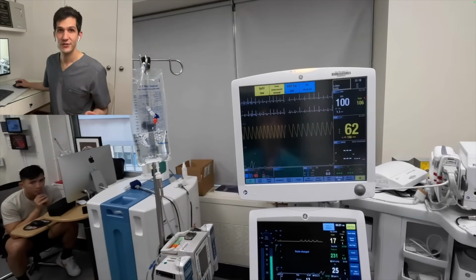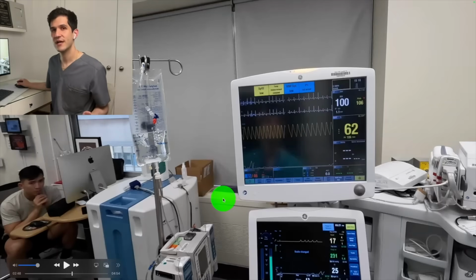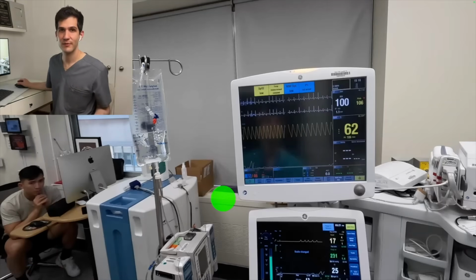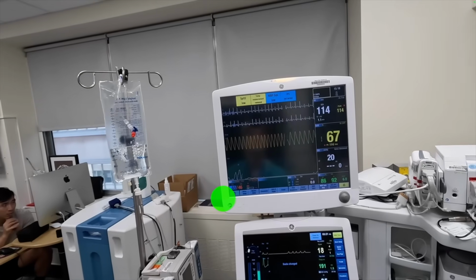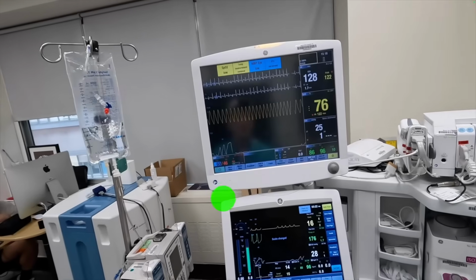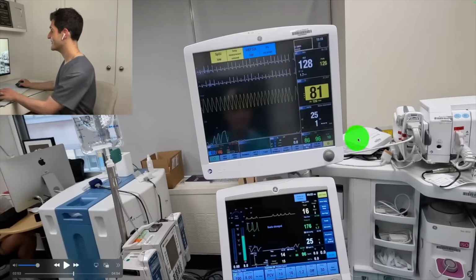You can see that the blood pressure cuff had just cycled and the patient's blood pressure dropped significantly, which is not surprising because anesthetic agents tend to drop blood pressure, but also the heart rate had slowed down considerably. And for pediatric patients, their blood pressure depends in large part on their heart rate, much more so than adults. So I'm not surprised to see that the patient has become extremely hypotensive. And obviously this is very reassuring to see the oxygen saturation coming up very quickly, so I'm happy about that.